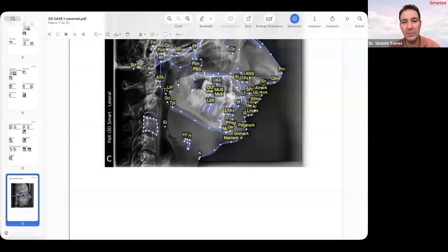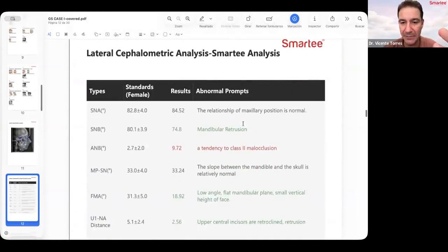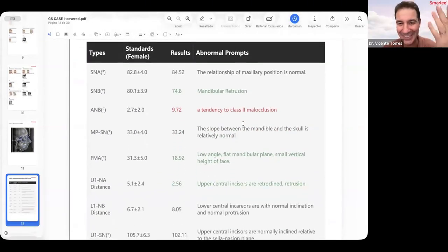So in that case, you make only mandibular advancement. What happens? You finish with the lower incisor proclined. The profile should be finished like maybe like this, or maybe you improve a little. But if you retroincline the incisors, and of course to retroincline the incisors you need to distalize the lower arch to increase the class 2, and increasing the dental class 2, you have more space for this mandibular advancement. So this is a very interesting, complex case, of course.